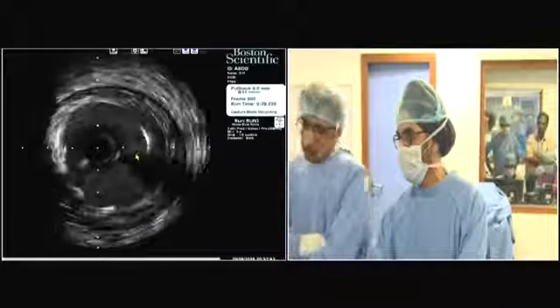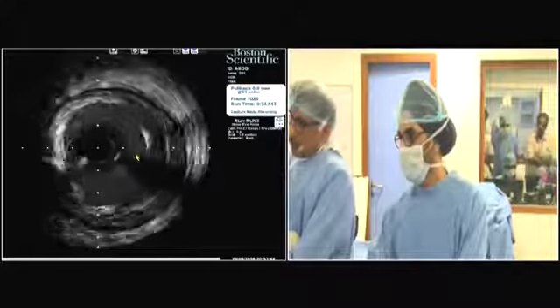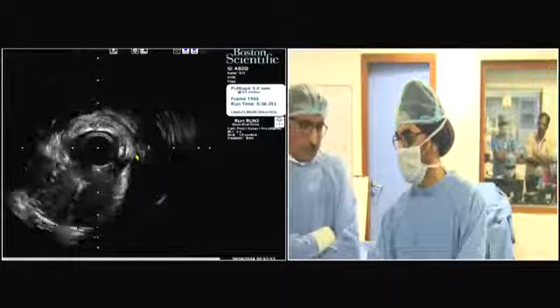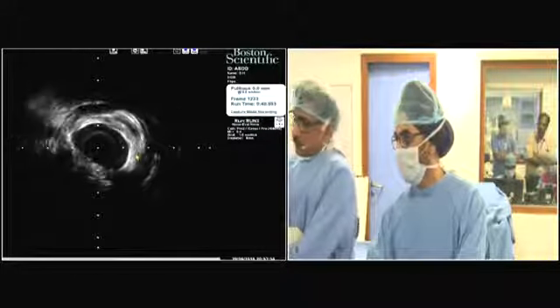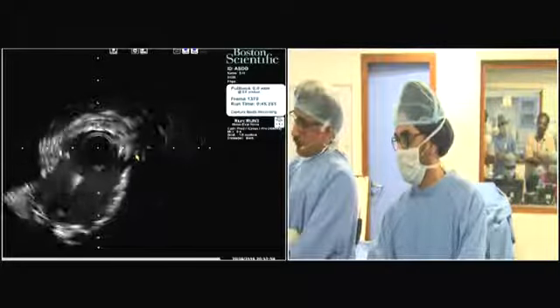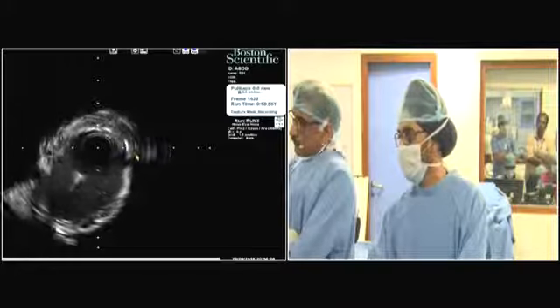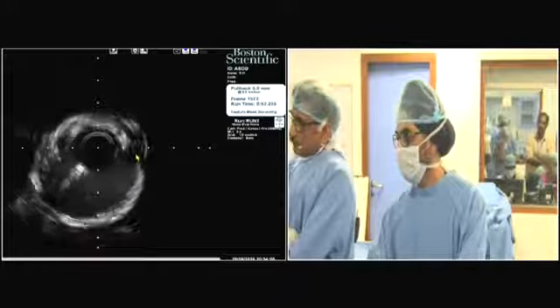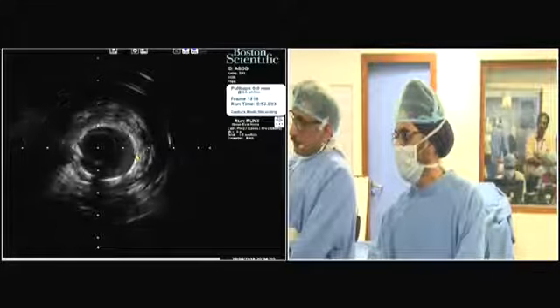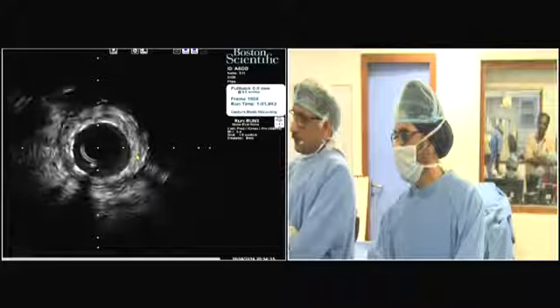Yeah, but I suggest to use a large non-compliant balloon to dilate the ostial diagonal again. I may do that. You agree? Yeah, I will go high pressure there because I did 12 atmospheres kissing at that point, so maybe at this point we can do a much higher pressure with a 2.5 balloon because the size is not bigger than that. Yeah, I suggest to use at least a 2.75 non-compliant balloon.